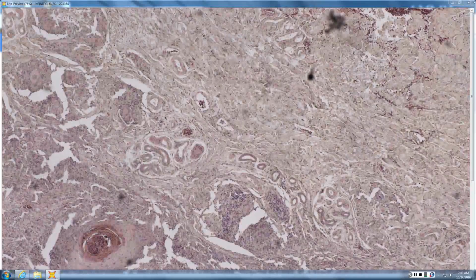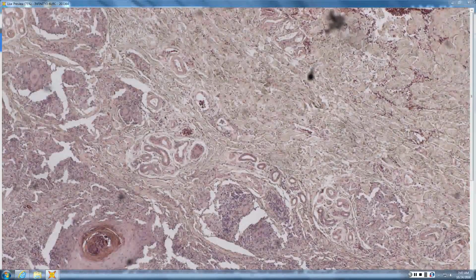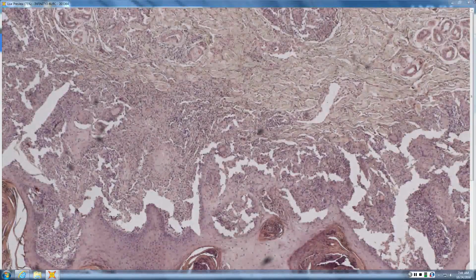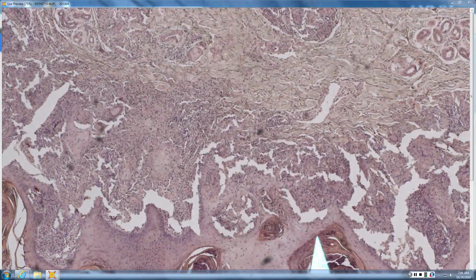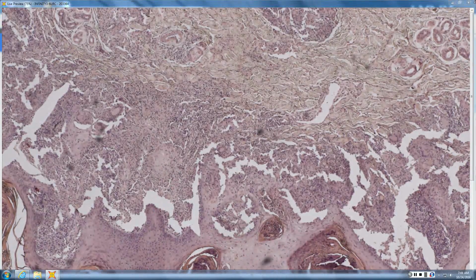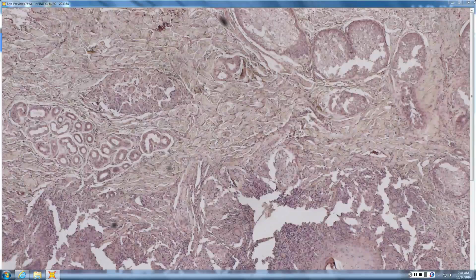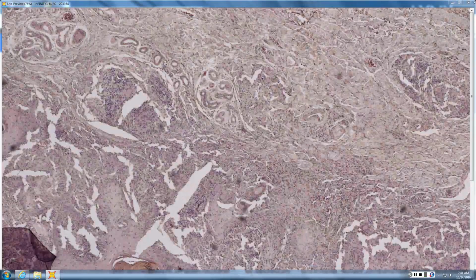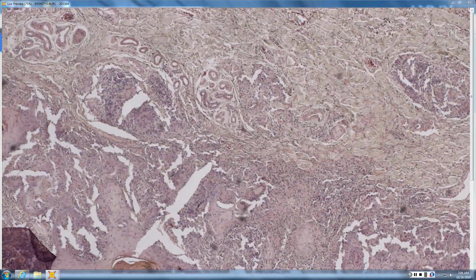So in looking at kind of the pink V's, I was thinking of, what's the name? So you're thinking of verruciform xanthoma with pink V's. That would be an epithelial proliferation with neutrophils and pink V's. Here we have a lot of pseudoepitheliomatous hyperplasia, neutrophil microabscesses, and granulomas, so a little bit different. Anyone want to jump in there? Like with the PEH. Yeah, exactly.